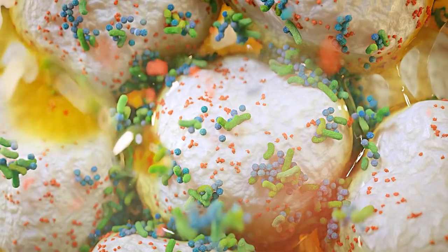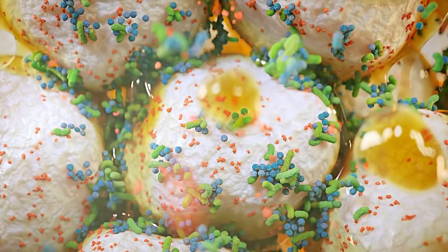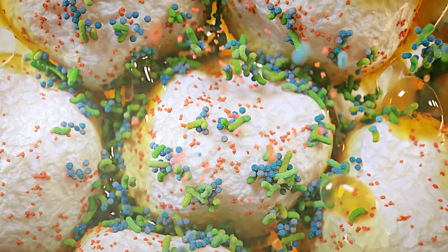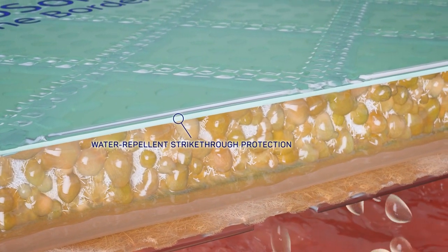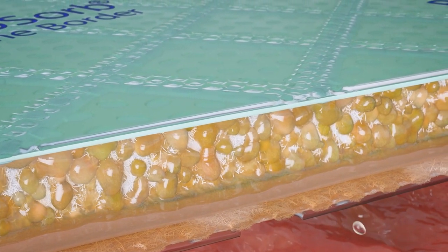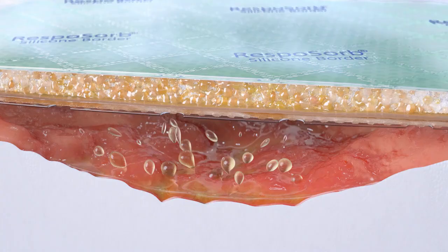Inhibitors of wound healing like matrix metalloproteinases and bacteria are sequestered inside the core. The green water-repellent strikethrough protection is designed to mask absorbed fluid, and the transparent backing is waterproof and at the same time highly breathable.